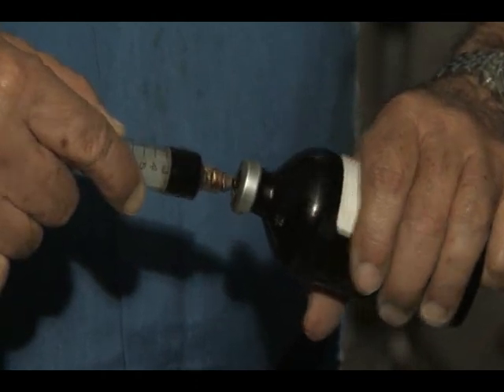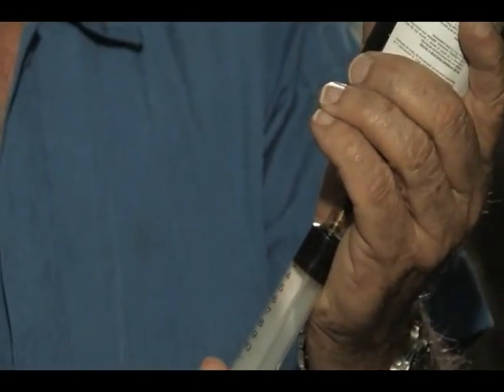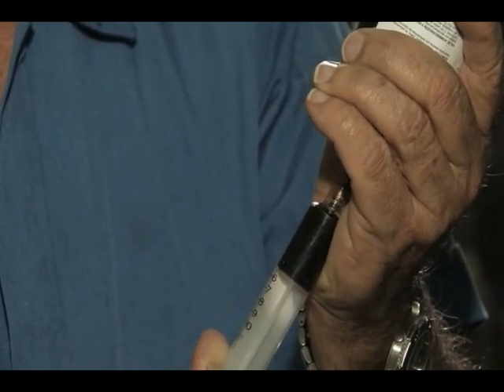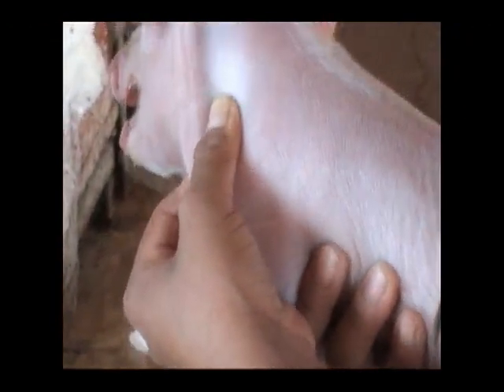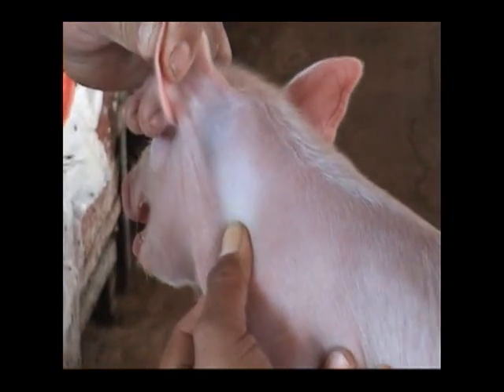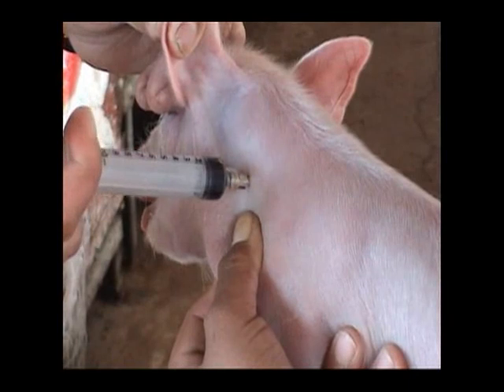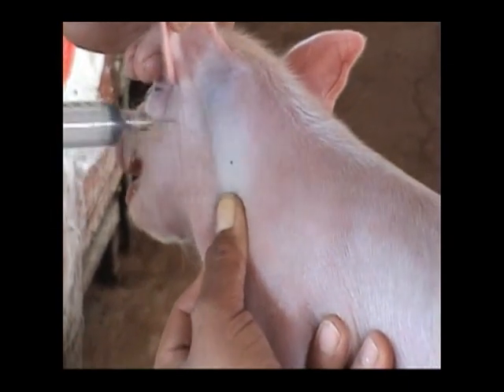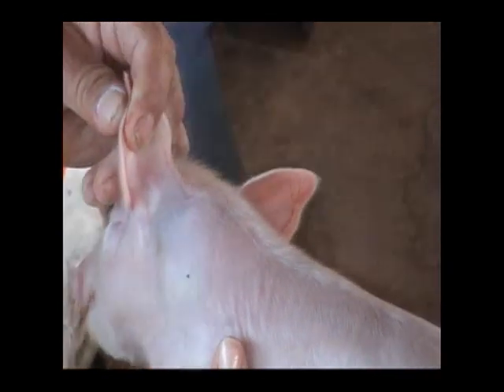Bien, pues ahora vamos a aplicar el hierro. Utilizaremos una aguja de media pulgada de longitud y calibre 20. Primero, lo aplicaremos en el cuello. Con el dedo pulgar, se jala la piel hacia abajo. Se introduce la aguja, se inyecta el hierro. Y una vez hecho esto, se suelta la piel, de tal manera que al sacar la aguja, el orificio de la piel regresa a su posición normal, hacia arriba, y no hay derrame hacia afuera.